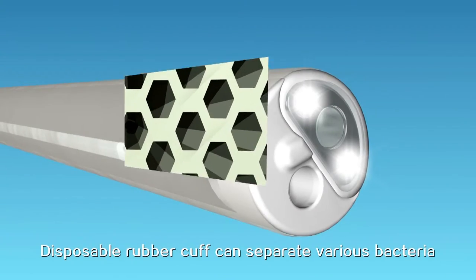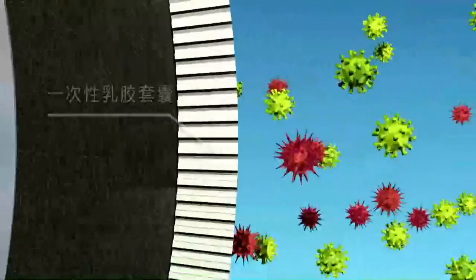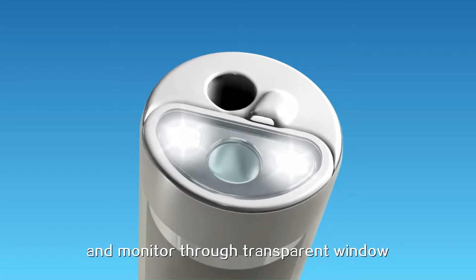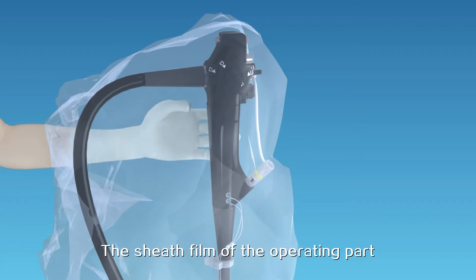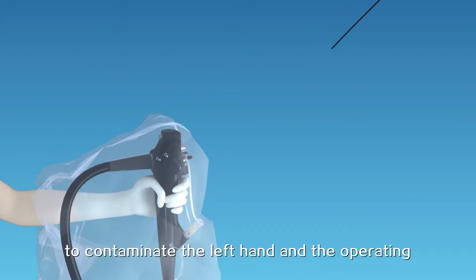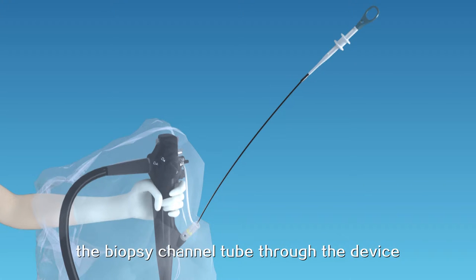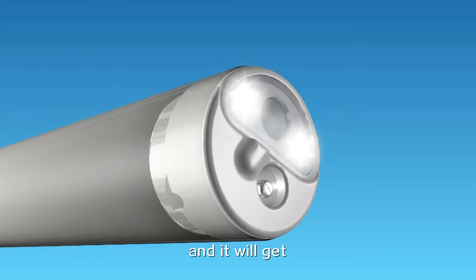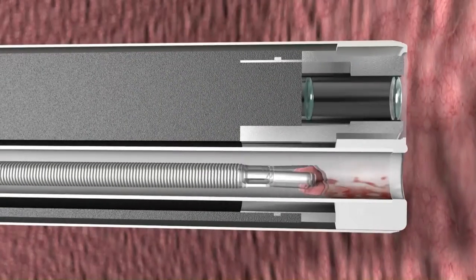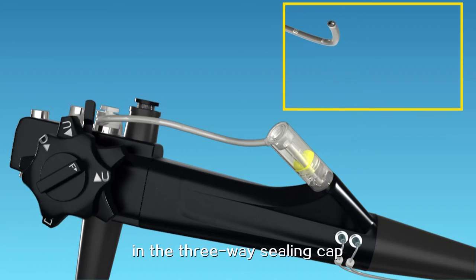The disposable rubber cuff can separate various bacteria, viruses, and prions, and the endoscopy can provide light and monitoring through a transparent window. The sheath film of the operating part can prevent the right hand, which is likely to be exposed to contamination, from contaminating the left hand and the operating part of the lens. Put the biopsy forceps through the biopsy channel tube through the device on the sheath film of the operating part, and it will get the biopsy through the disposable biopsy channel tube.